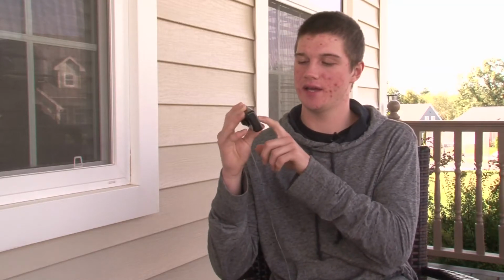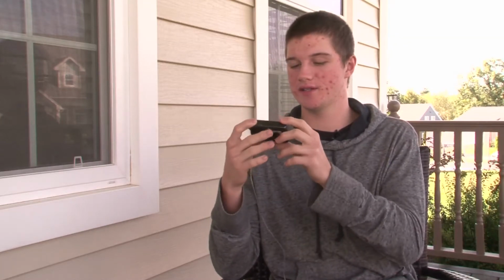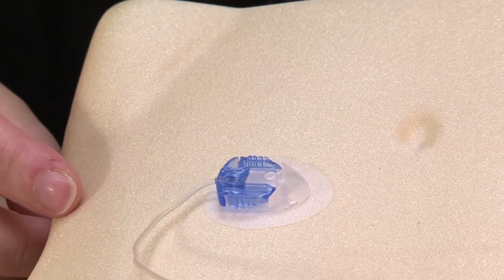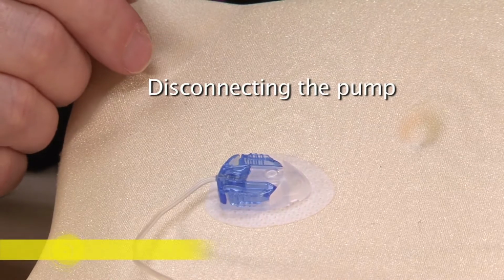In suspending the pump or disconnecting the pump, there are two options you can do. There's one where you hit a series of buttons on the pump, and there's an option to suspend, which suspends the insulin flow into your body. And then there's the other option, which is just disconnecting the actual site off your body and stopping the flow of insulin.